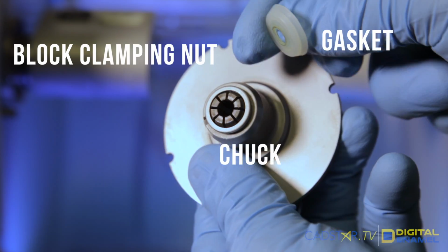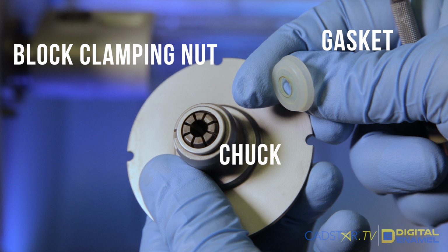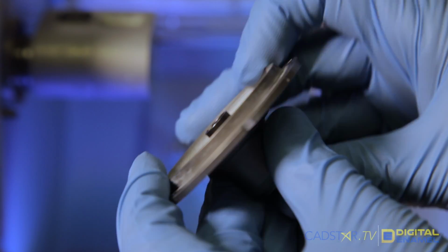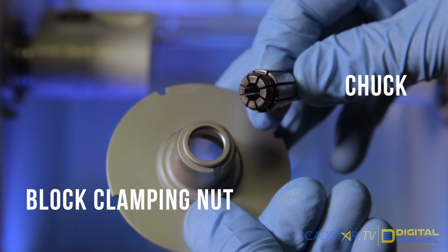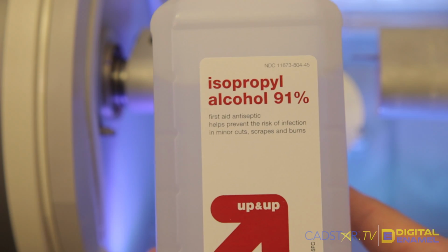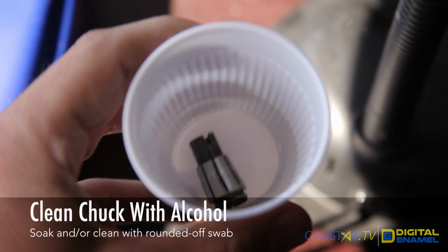and we'll have to get that metal piece in the middle, which we call the chuck, out of the block clamp. To do this, we'll set it either against a solid surface or with your thumb, and it should just pop right out. And now you have the chuck and the block clamp. So now all the pieces are disassembled. The first step in the automatic block clamp is to clean all these pieces.